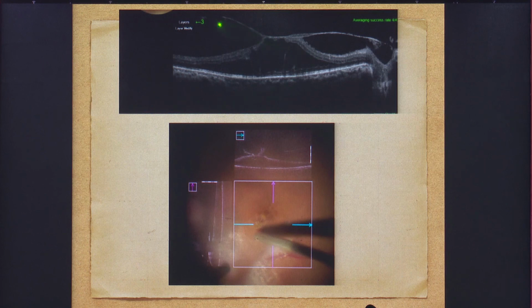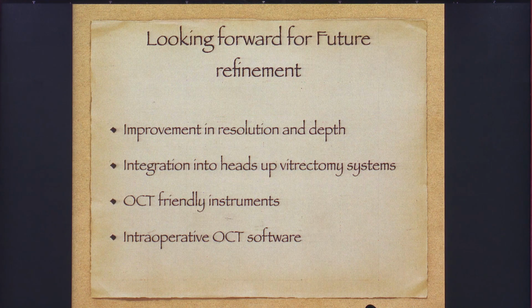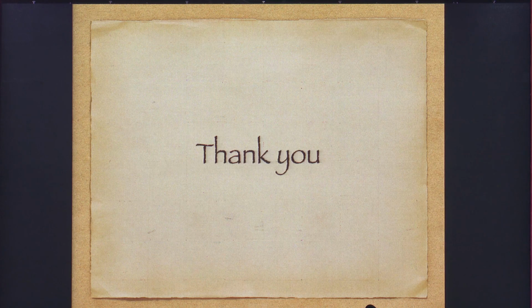And again, I showed you our standard spectral domain or SSOCT, and this is how it looks intraoperatively. People are working on the resolution, but the resolution of intraoperative OCT is still less than what we have in the OCT in the office. So we are looking forward to improvement in resolution and depth, and integration into heads-up vitrectomy, as sir has already said, there are digital systems. We want incorporation into that also, and the intraoperative OCT software. So many things people are working on with the MIOCT nowadays. Thank you.